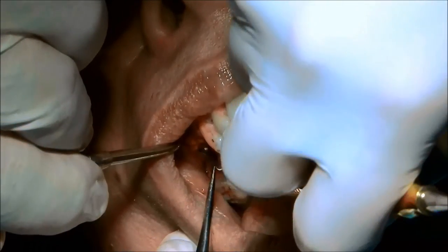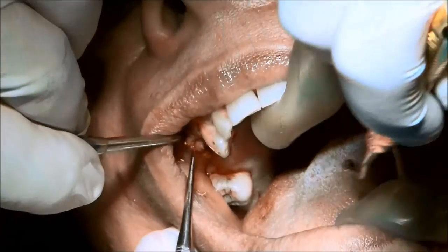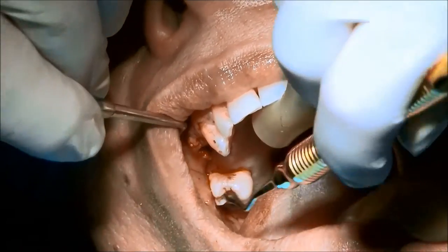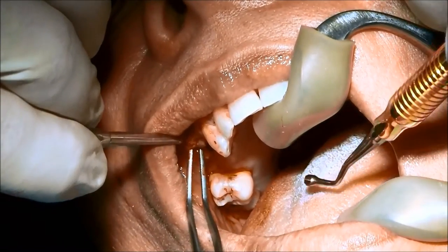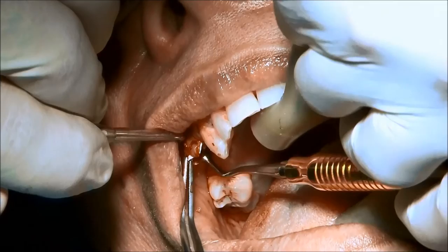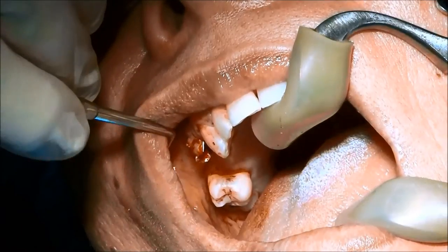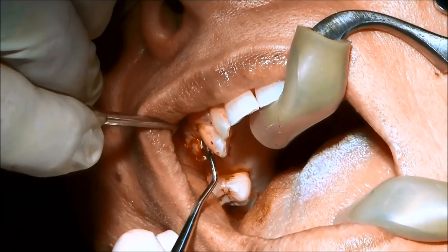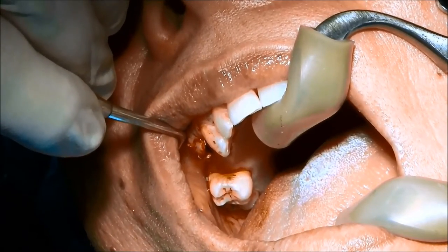We're going to inspect the surface of the implant and make sure we get that bone all the way down on the facial surface — trying to take pictures, trying to open the flap. We're going to keep that membrane to protect that facial flap so we can position the bone — typically on that facial part of the socket.